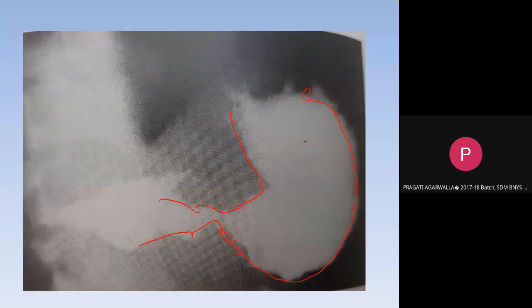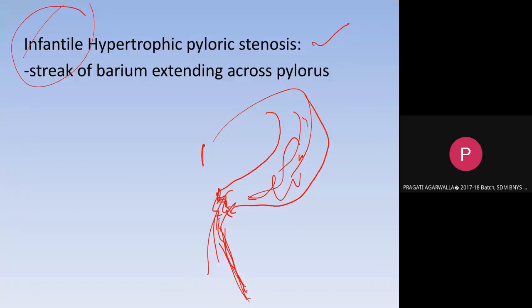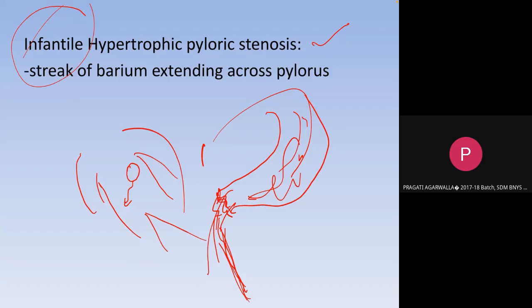And one more nice thing you can see is, if you observe the baby carefully, there will be one mass formation, and this mass will move like this, and it will disappear. That is the peristalsis which is commonly happening, and it is seen from outside. I've seen a case like this. It's very nice to see, and the child was having all these symptoms.